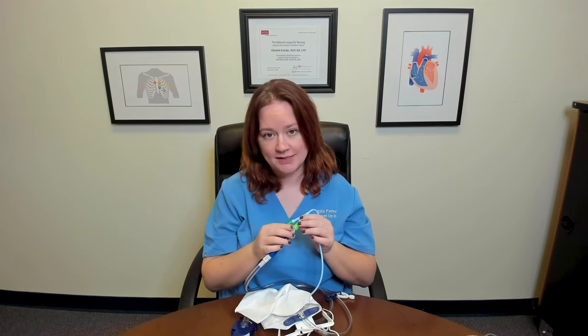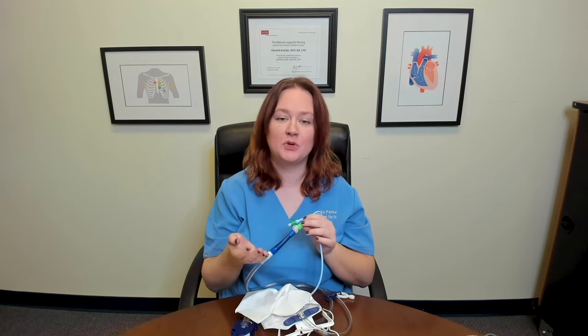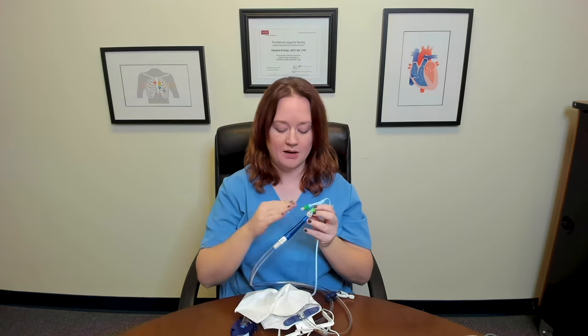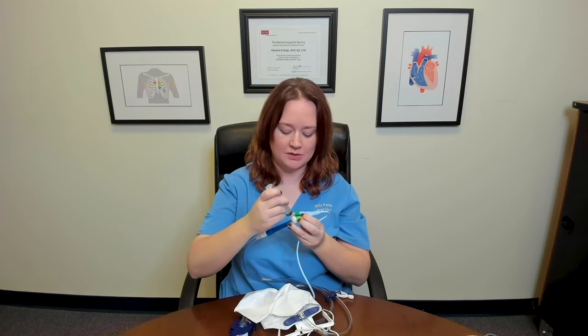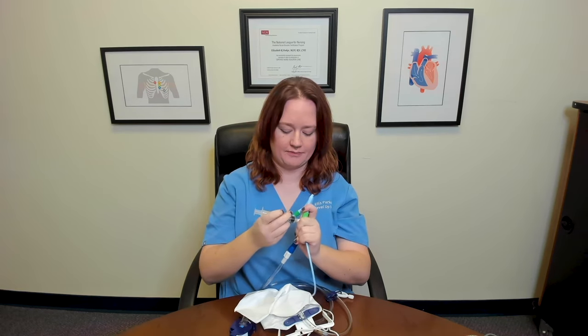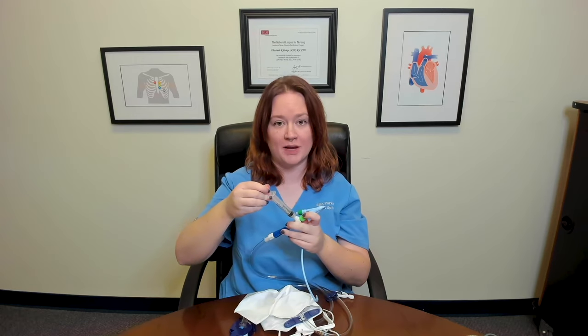The other thing I wanted to point out is that most catheters now come with a Luer-lock port. Occasionally you'll still find ones with a rubber stopper that require a needle to get a sample, but most are Luer-lock. To obtain a urinary sample, I would clamp my tubing so urine can't proceed into the bag. Once this area has urine in it, I would get a 10-milliliter Luer-lock syringe, clean my port site, attach my Luer-lock syringe, and from there withdraw my urine sample.